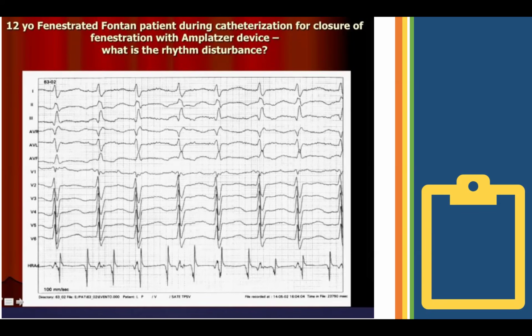Yeah, it's not that easy, I would think, to record atrial electrogram from an external conduit, right? Because you have a piece of Gore-Tex tubing which is between you and the atrium. Now, I think you might be able to record at the bottom or the top, where the anastomosis is, at least maybe near the IVC. But when you see such a big electrogram, this is almost certainly someone who either had an old style Fontan or a lateral tunnel, because remember that in the lateral tunnel, the surgeon incorporates the lateral wall of the actual true right atrium. So you can, in fact, record from there.